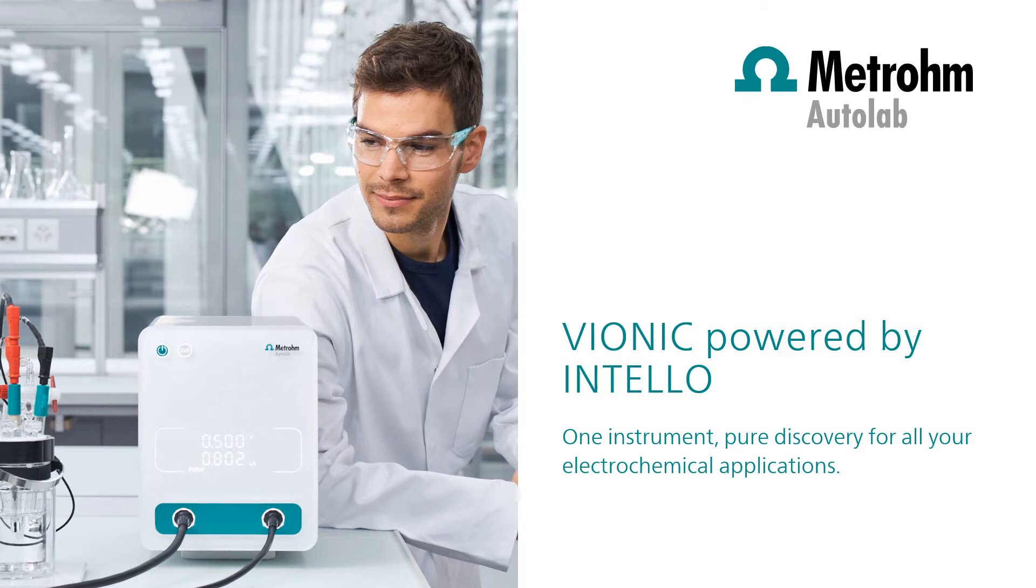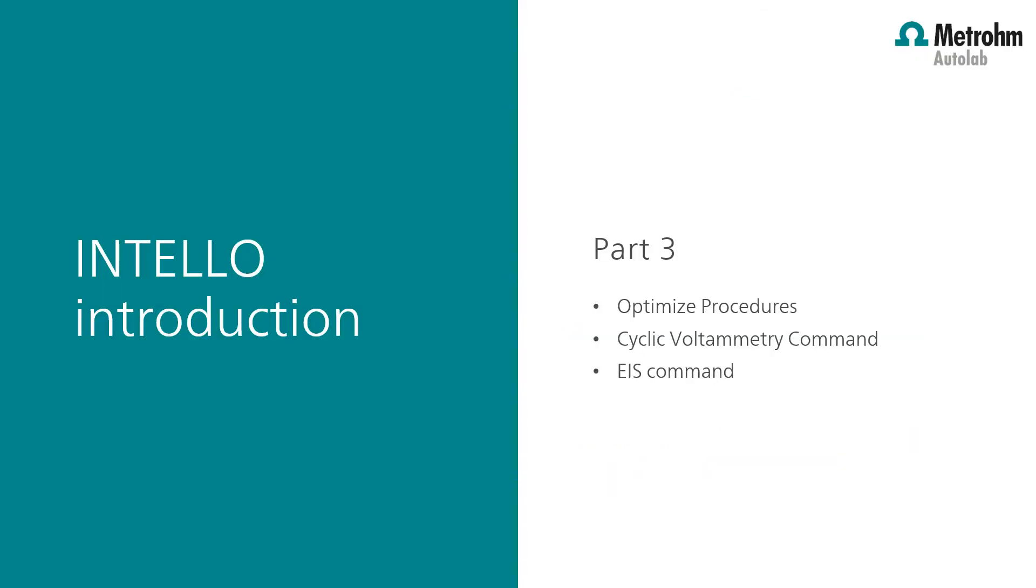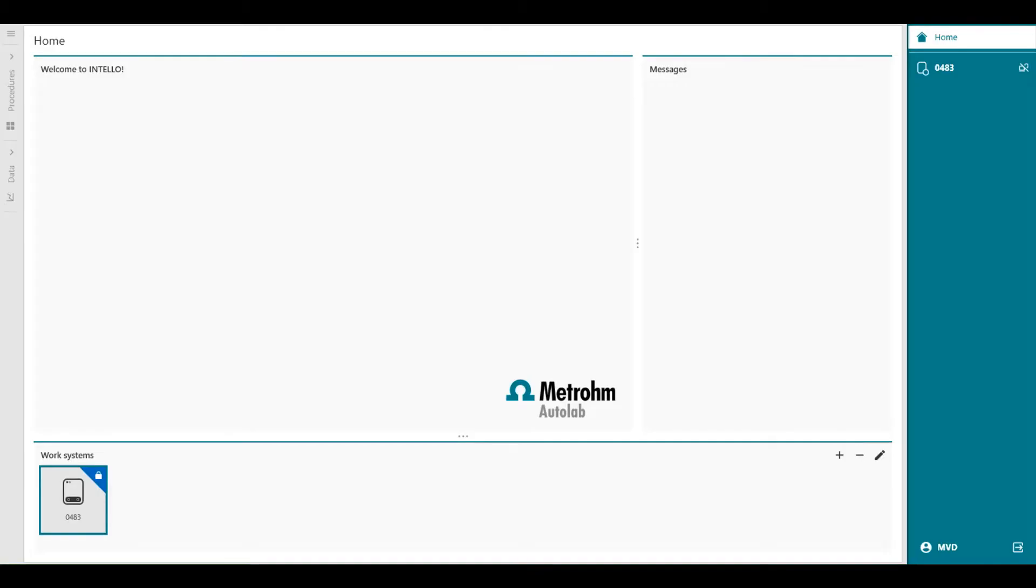Welcome to INTELLO videos. This video provides a general introduction to the new INTELLO software. The INTELLO introduction is divided into five separate videos. For the best understanding, these videos should be viewed in order. This third video will introduce how to optimize safe procedures, adding a cyclic voltammetry command and have a closer look at the CV parameters, and at last the electrochemical impedance spectroscopy command. Let's continue for a moment with the three chronopulses procedure, which we've used previously.